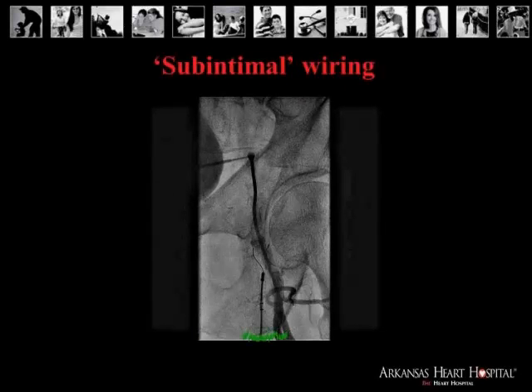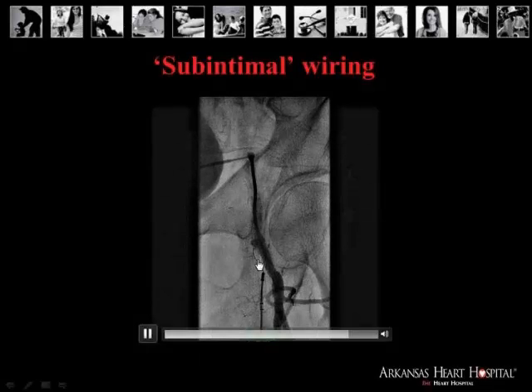At this point, we could not cross the proximal cap due to the fibrosis and the entire length of the catheter that was in the body. We tried initially to advance the catheter. We also tried to take a wire. However, here you can see that the Regalia wire wants to go subintimally into the common femoral artery.